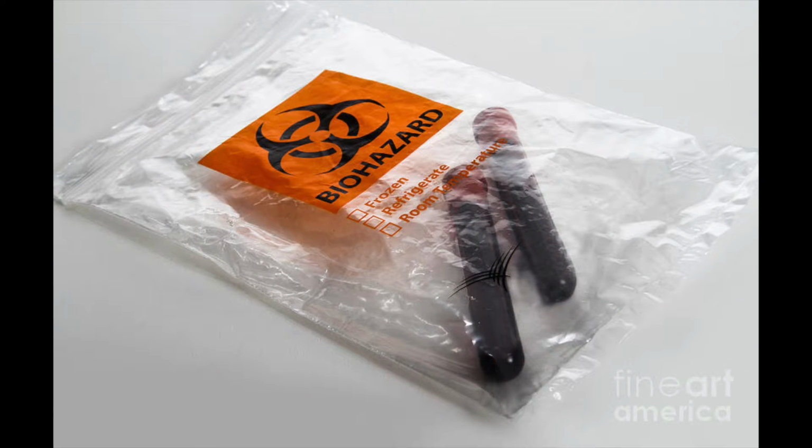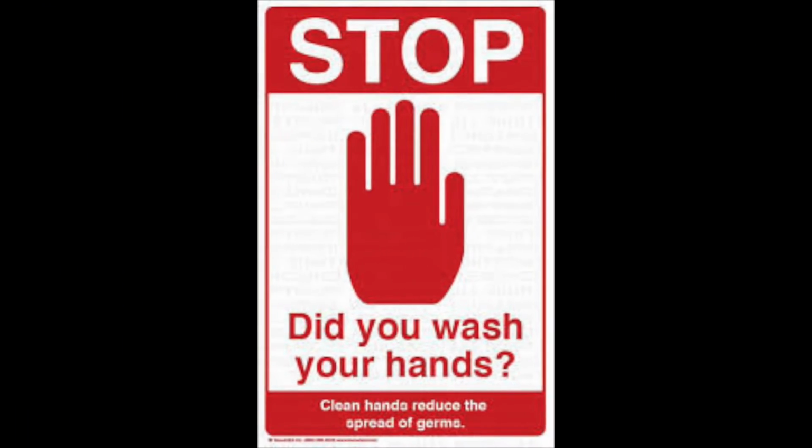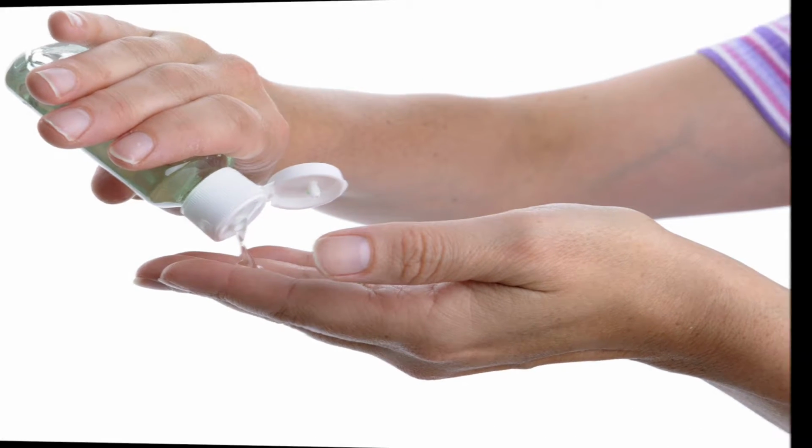The tubes are placed in a plastic Ziploc bag. The medical assistant removes and disposes his or her gloves appropriately and washes or sanitizes his or her hands before returning to patient care duties with this or another patient.